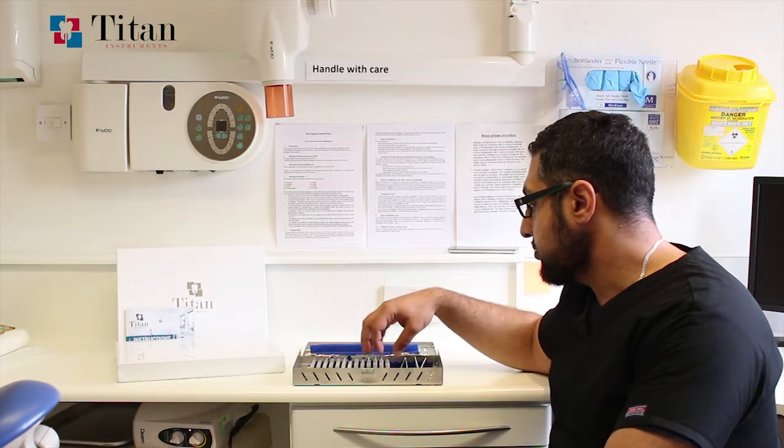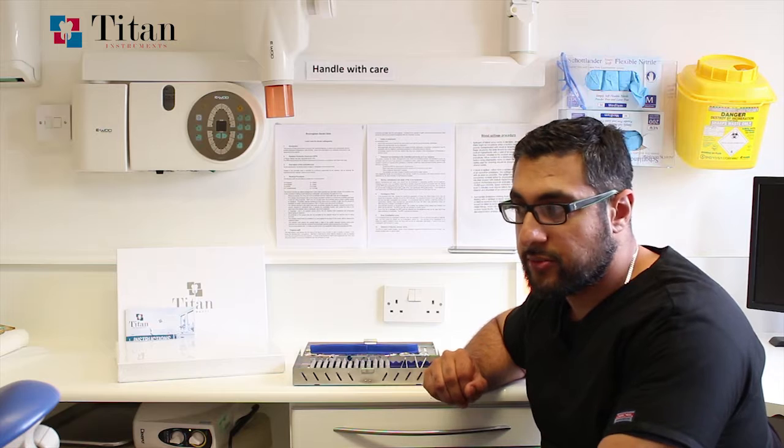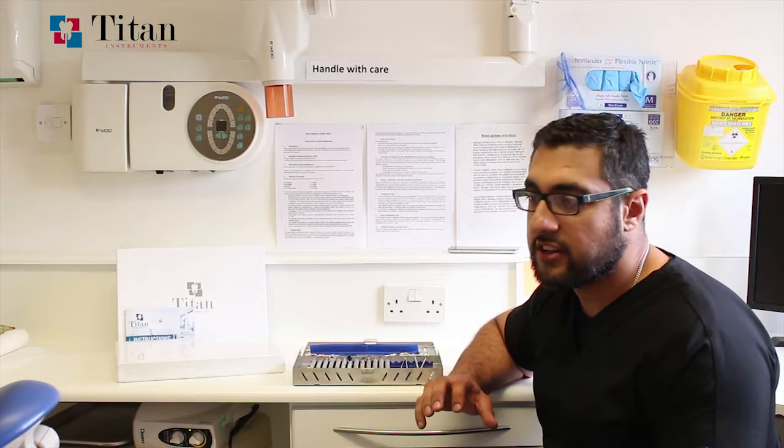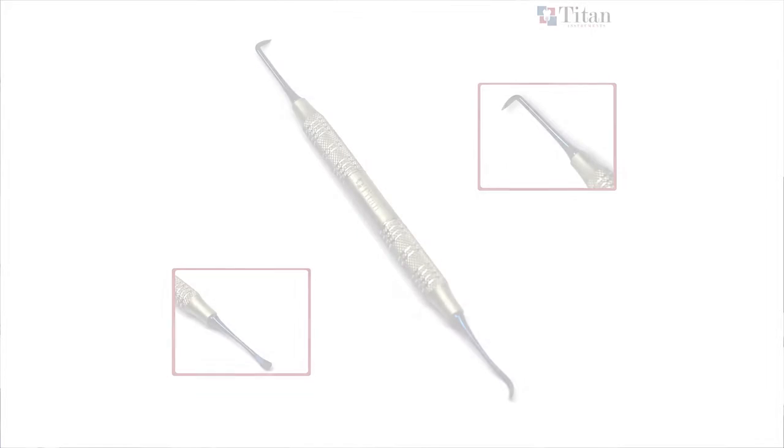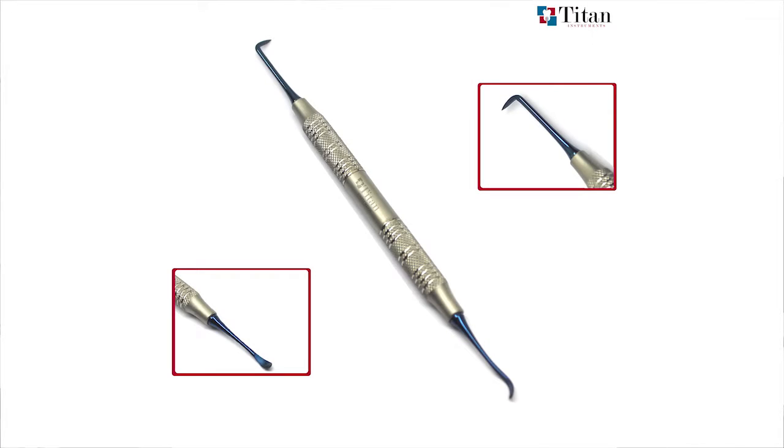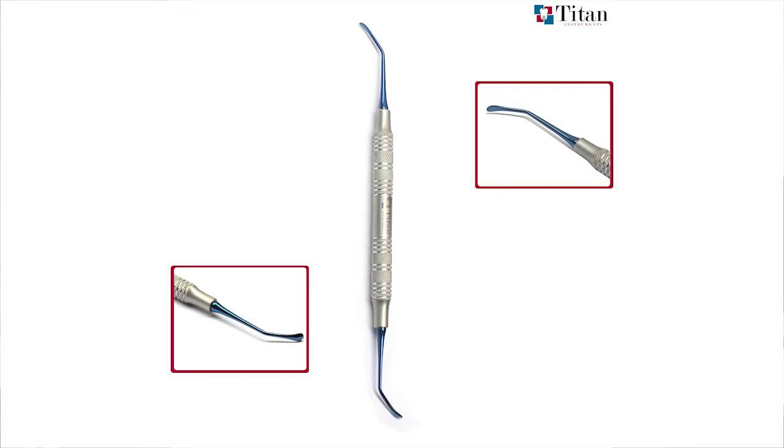The next section covers cleaning and debridement of the site with three instruments. First is a Mitchell's trimmer, which has a sharp curved end for curettage and an angled end for removing spicules of bone. Then we have a Lucas curette and a straight excavator for removing soft tissue from inside the socket.